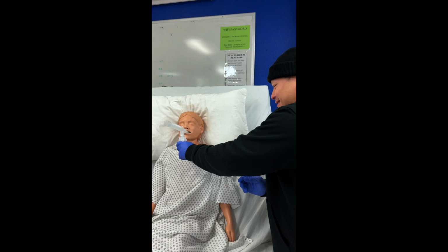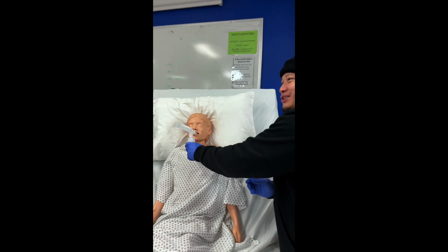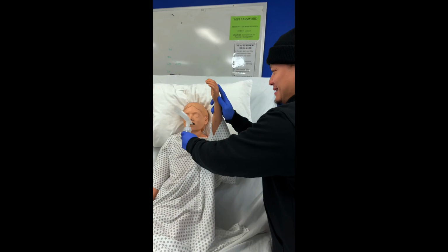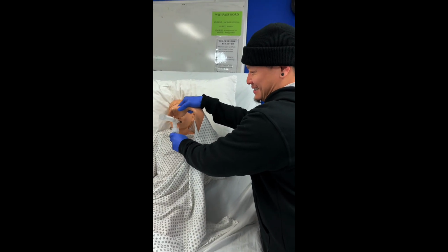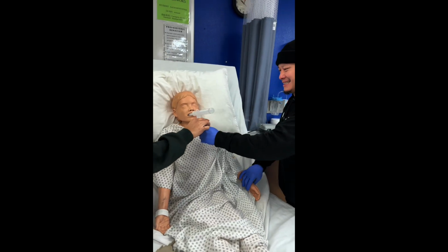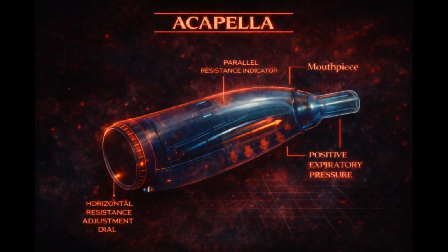The treatment continues until the nebulizer begins to sputter and no visible aerosol is present. Throughout the treatment, I monitor the patient for tolerance, changes in breath sounds, heart rate, and any signs of distress.